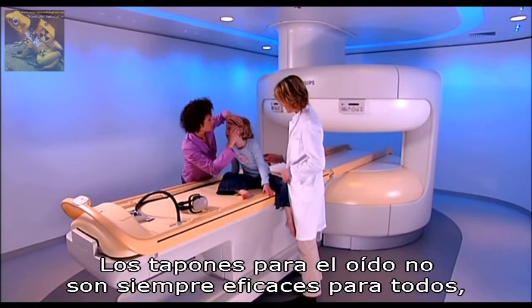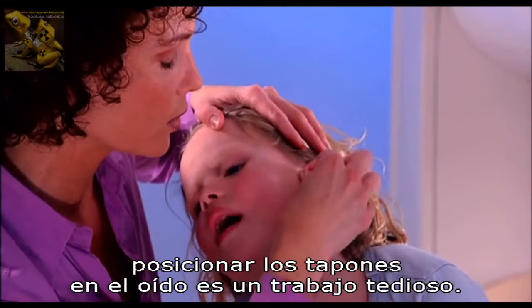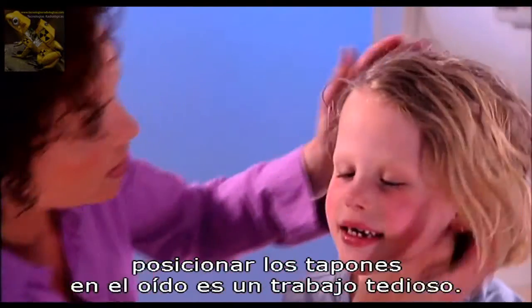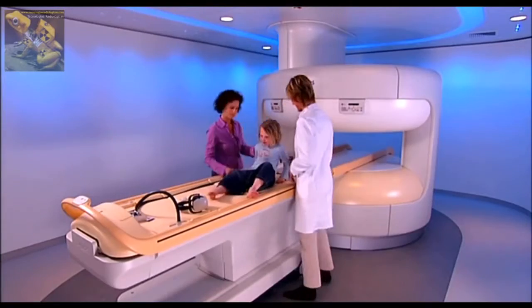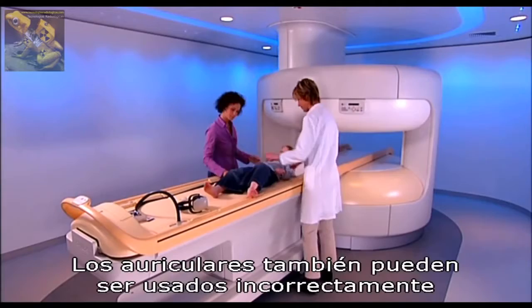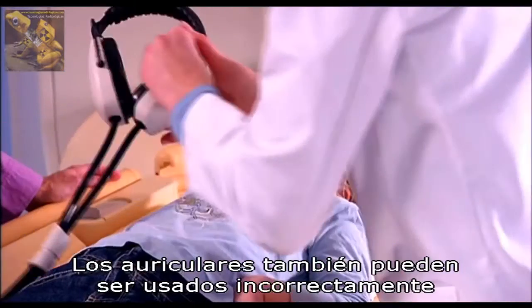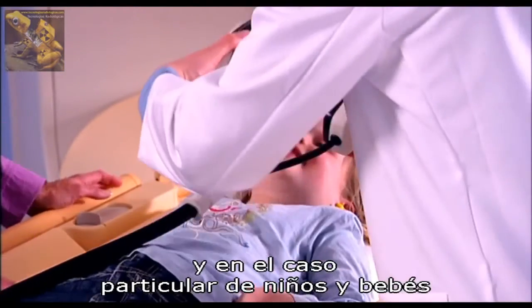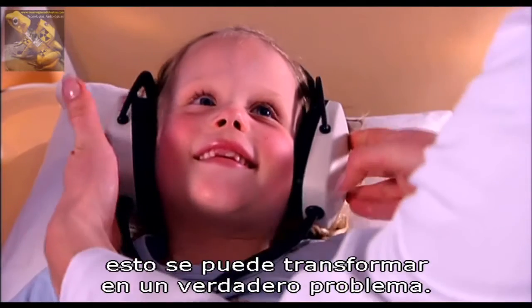Earplugs are not always effective for all patients; positioning of the plugs in the ear is a tedious job. Headsets can also be applied incorrectly, and in the case of children and babies this can become a practical problem.